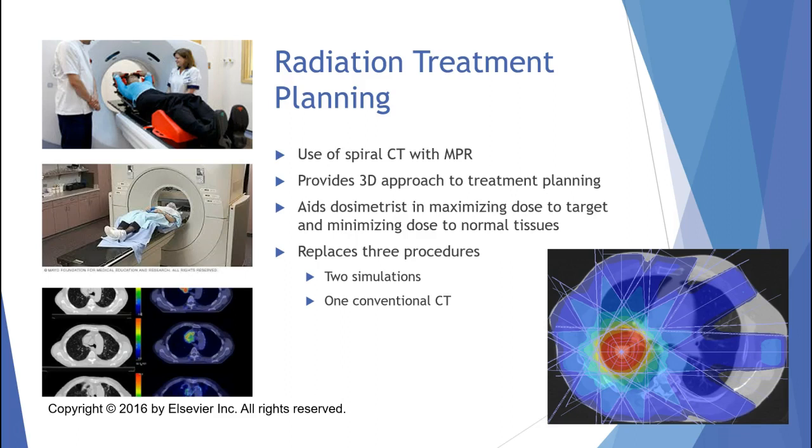So most people have to go through several treatments, if not a dozen treatments. And having a mask or a form makes sure that the patient is in the same exact position each time. So what they do prior to treatment is they make the patient form or mask. They bring the patient over to the CT scanner, they put that mask on, and then we scan them in CT. And that scan gives them anatomical landmarks in addition to the form around them.